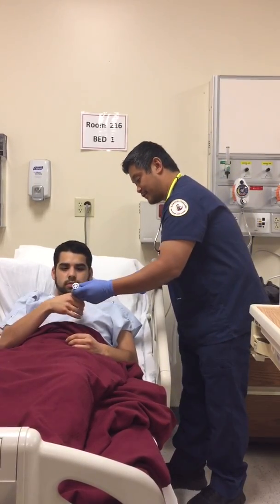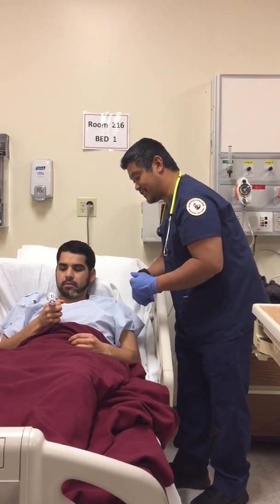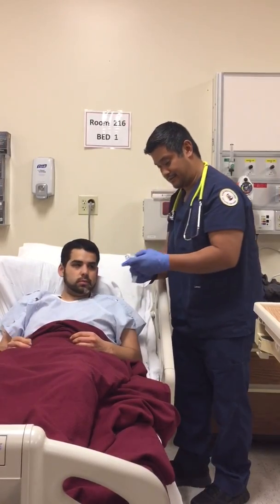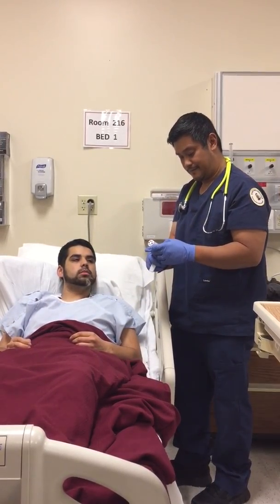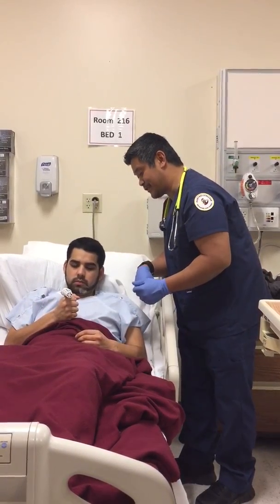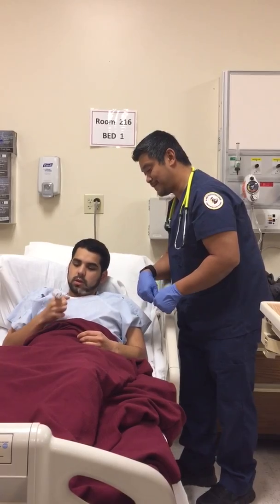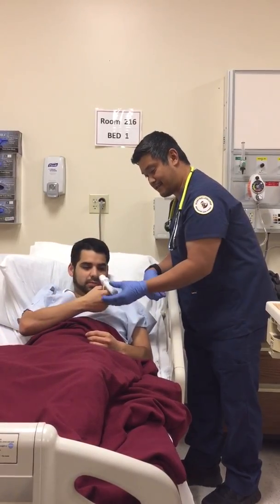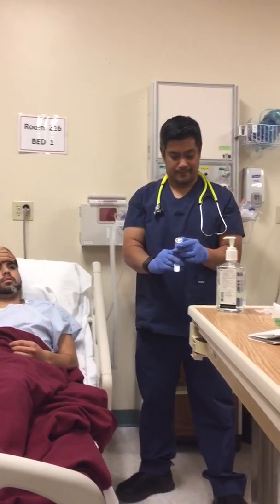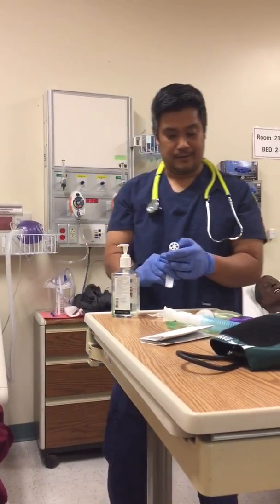Okay, 2 more times. Go ahead and take a deep breath in. All right, thank you. All right, one last one. Go ahead and take a deep breath in. Make it the best one. All right, great job. So I've got a reading of 600. It's very good.